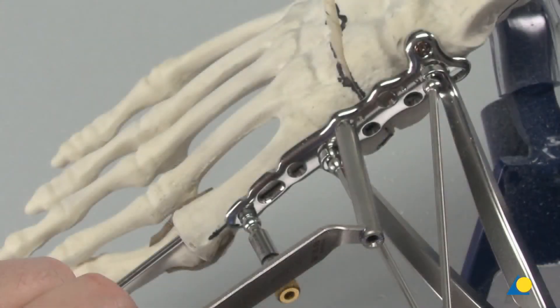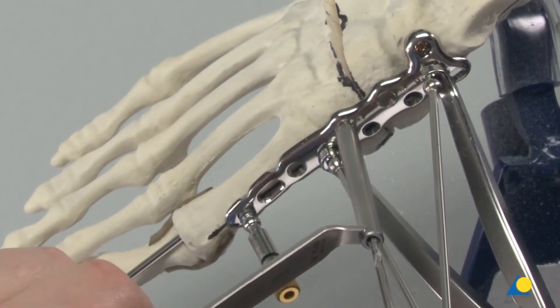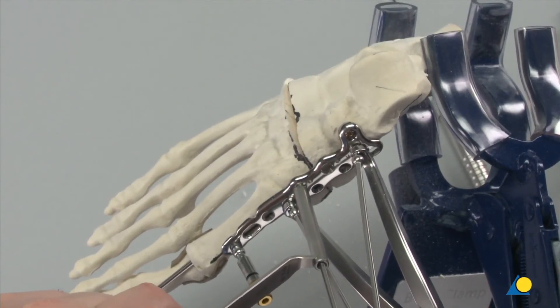The second 3.5 mm VA locking screw will be inserted coaxially into the lateral hole in the cuneiform part of the plate. The 2.8 mm hole is drilled laterally across the midfoot to the desired depth. Clinically, this can be done under image intensifier control.